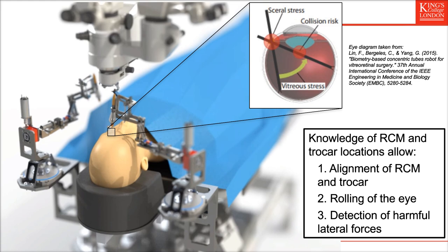To reach the area of interest, the surgeon has to insert surgical instruments through the eye. A trocar, which acts as an access port to the interior of the eye, is inserted into the eye at the safe location termed the pars plana, whilst providing strain relief from the movement of the surgical instrument that would otherwise cause ocular trauma. In recent decades, the development of robot-assisted vitreoretinal surgery has become more prevalent. Benefits of this include the increase of precision and accuracy, consistency, hand tremor removal, faster patient recovery times due to reduced trauma, and the targeted delivery of new regenerative therapies.